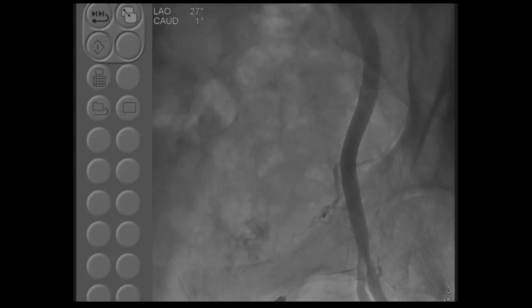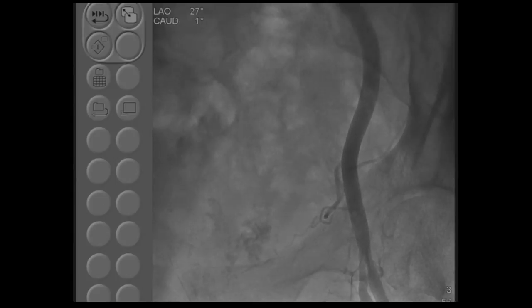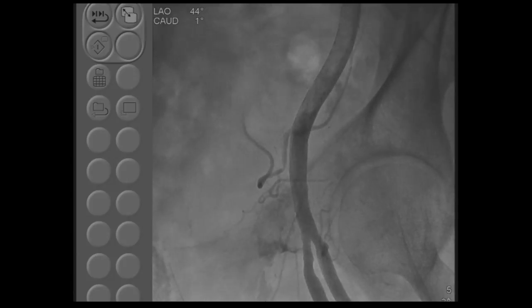This was the first puncture, which was just at the level of the bifurcation, not comfortable to do the 2 pre-close at that level. As we did the first pre-close, what you do is check the pulse. Pulse was faint, so we took it out and just went with the sheath on the left side. So right now we will have our procedure sheath on the left side, and we'll do the Impella on the right side.